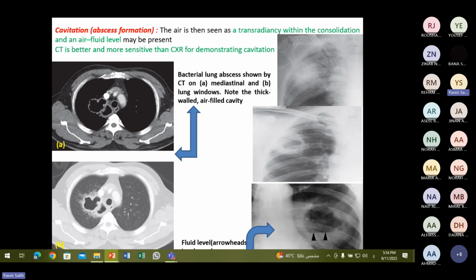by the abscess. نعرف الابسس ده بيتكون كيف؟ الابسس في البدايه بيكون lung pneumonia عاديه، يعني يكون عندنا infection such as consolidation with air bronchogram. Then within the lung بيحصل لنا air accumulation and then develop air fluid level. This is the stage of lung abscess. Lung abscess characterized by this stage: consolidation, air in the center and there air fluid level.